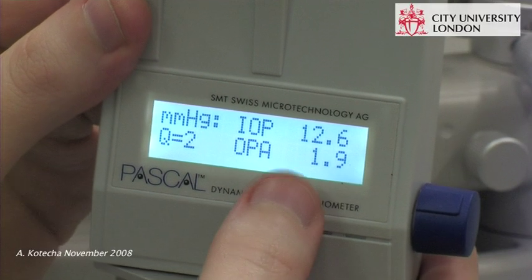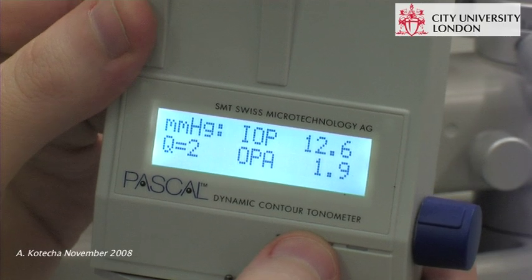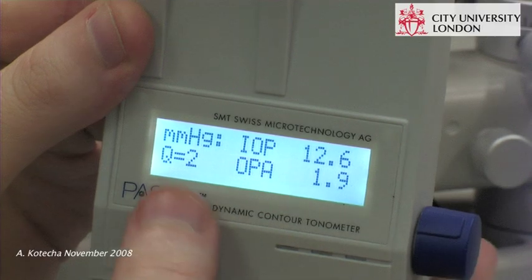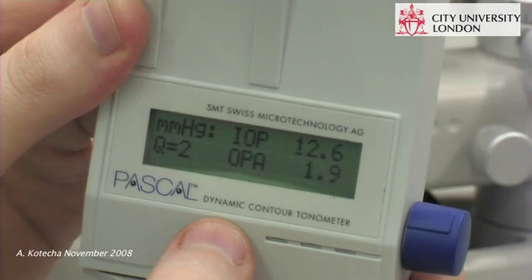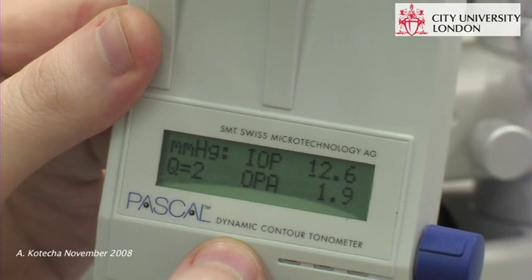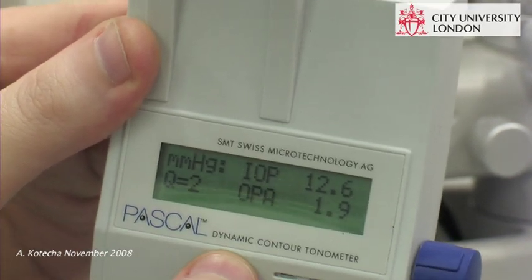So this patient's intraocular pressure is 12.6 millimetres of mercury with an ocular pulse amplitude of 1.9 millimetres of mercury and a quality reading of 2 out of a possible 5, where numbers 1 and 2 can be accepted, but a quality reading of 3, 4 and 5 should be discarded.